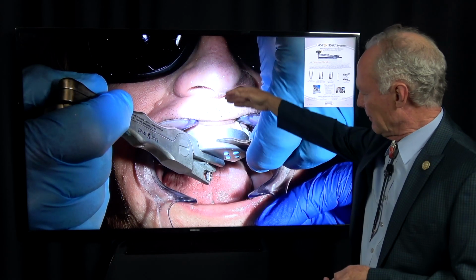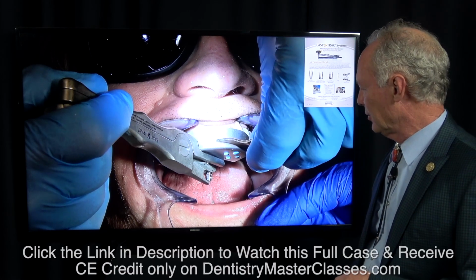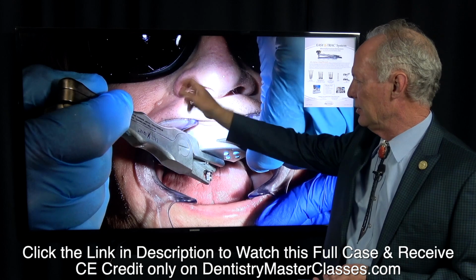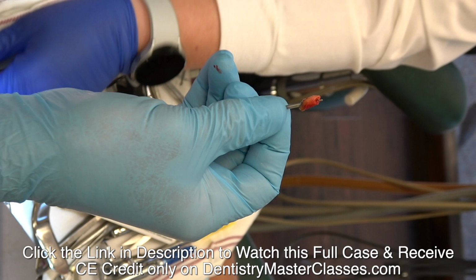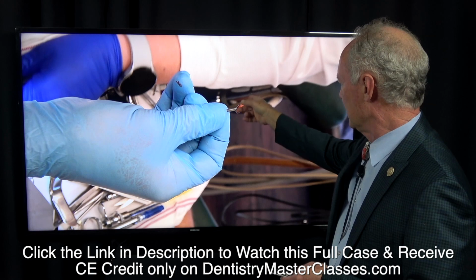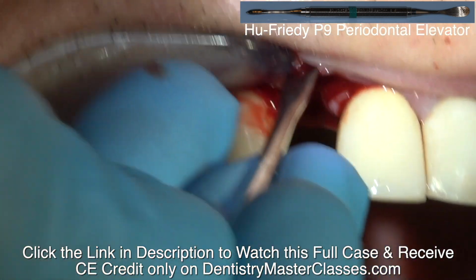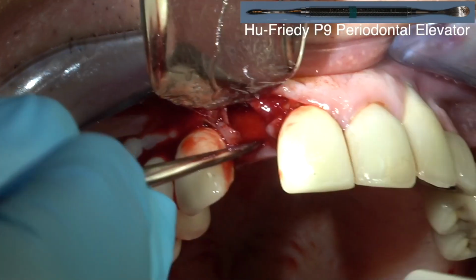You know, either the threads have stripped through the tooth and the screw has pulled out of the tooth if there was decay in the tooth or something, or the tooth is extracted when you can screw this and there's no tension. So fortunately, in this case, and most of the time, the tooth has been extracted. So you can see I've performed an apicoectomy on this tooth, or somebody did years ago, and there's the tooth. So I'm reflecting this tissue so I can see the alveolar crest.